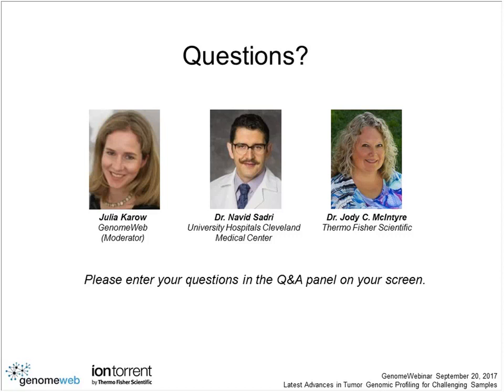I see, okay. Dr. McIntyre, will the Oncomine Knowledge Base Reporter work with any VCF file of cancer variants that somebody uploads? For example, will it work with custom AmpliSeq panels or also with non-Ion Torrent panels? That's a good question. We get that often. We have designed it for our Oncomine oncology assays today, and we are looking to support more of the custom AmpliSeq assays in our future releases.